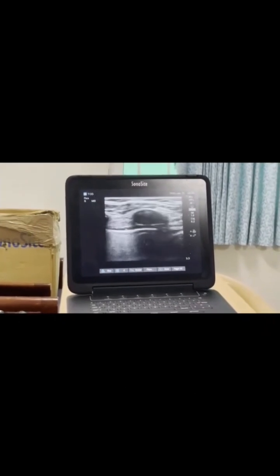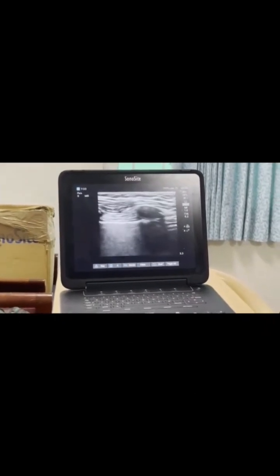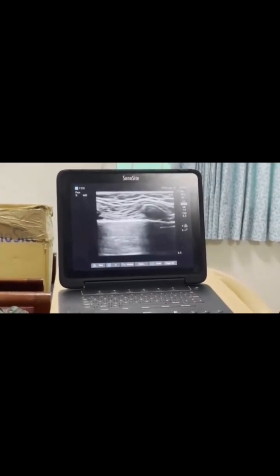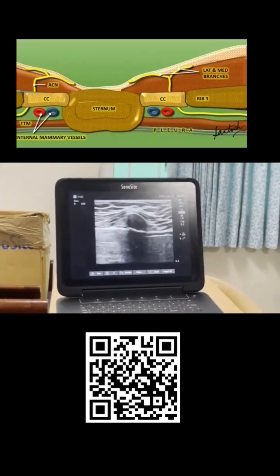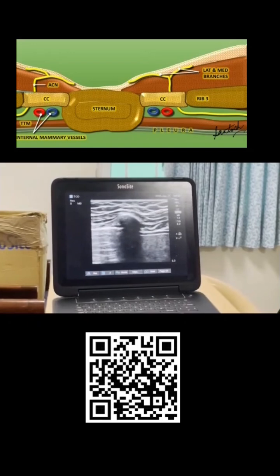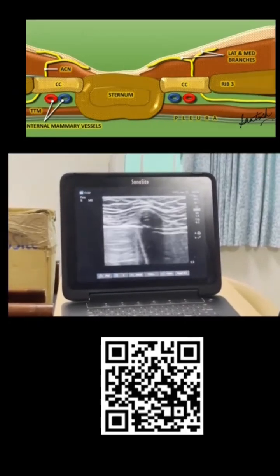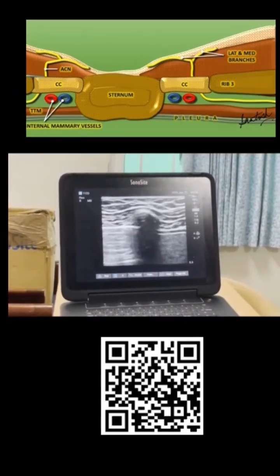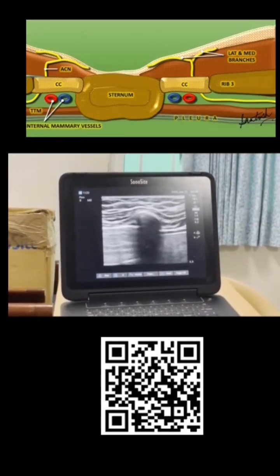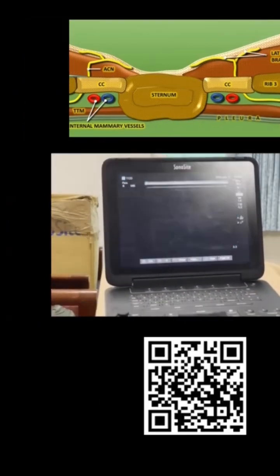So now we will follow this laterally. Can you see here the change in echotexture? So this is the costochondral junction, and this is the rib.